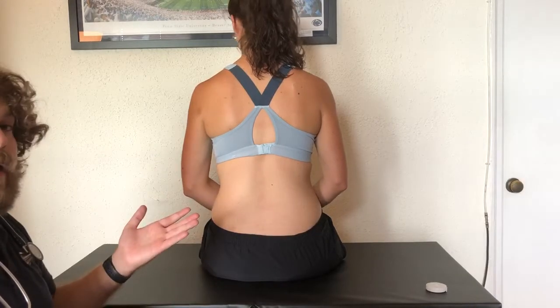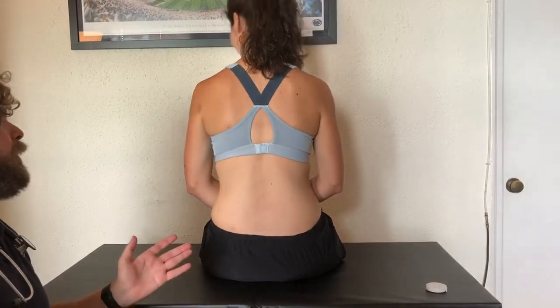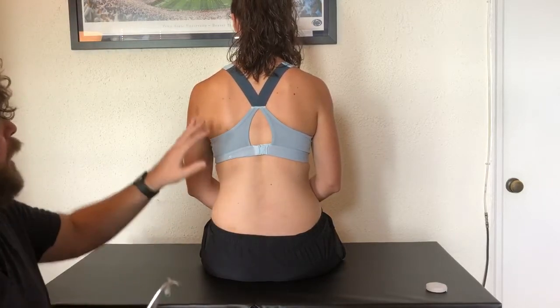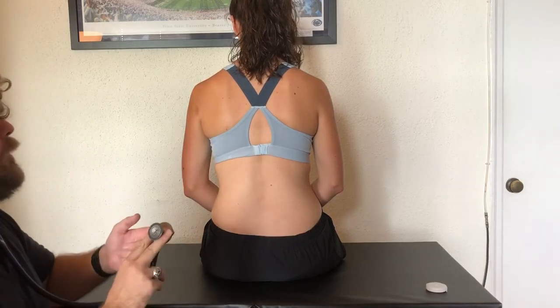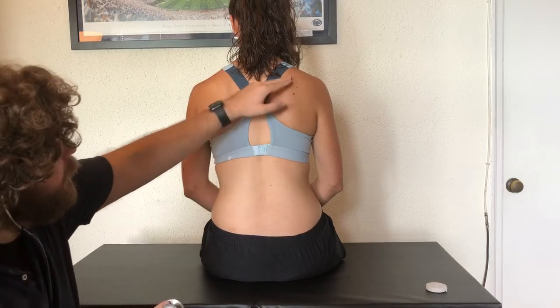We have Juliet here as our model. Thanks again, Juliet. Do I have your permission to listen here? Yes. Okay, great. So we're gonna be feeling around kind of around your shoulder blade, and we'll be auscultating there. So placing our scope in, giving a tap. Again, spine and scapula, inferior angle.